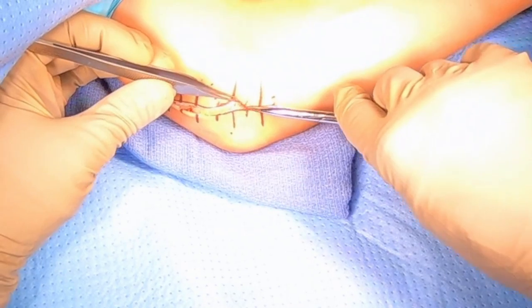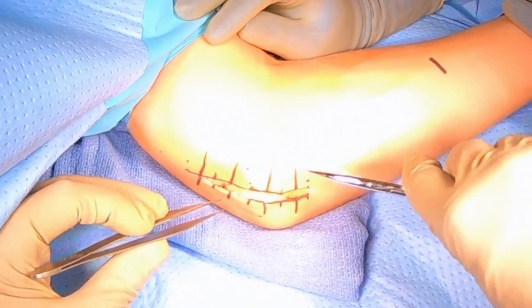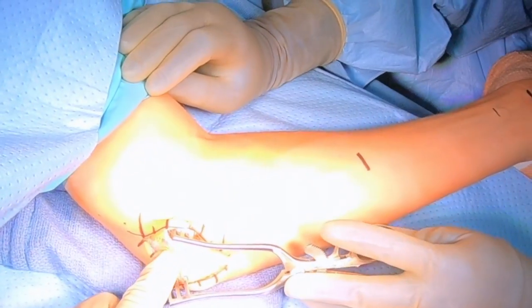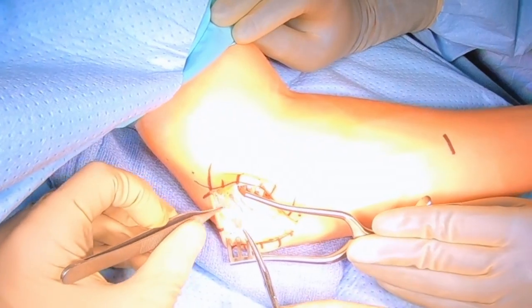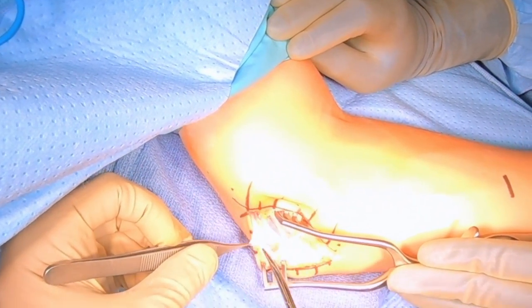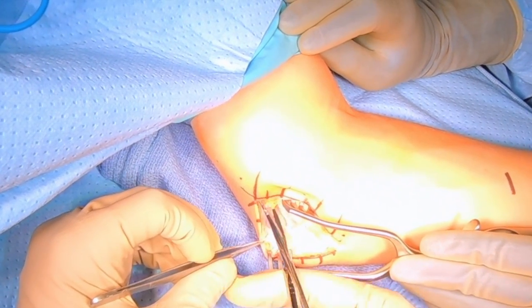We'll dissect here carefully because right beneath the skin is the ulnar nerve, which is going to be a major component of this procedure. Getting that nerve protected throughout the procedure is really critical. You can see me there palpating the nerve and then carefully dissecting around it as it travels right next to the triceps and right behind what's called the medial epicondyle, which you'll see later on in the procedure.